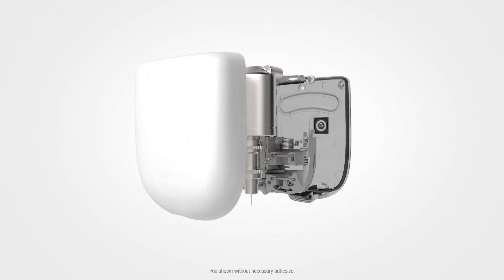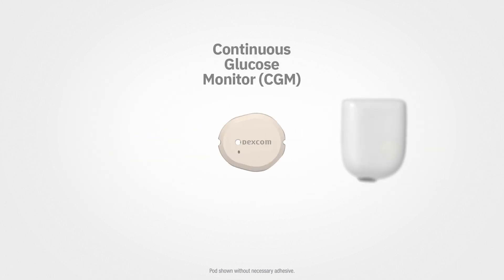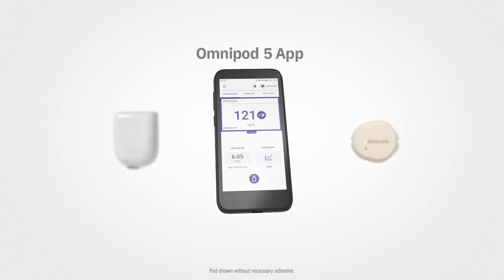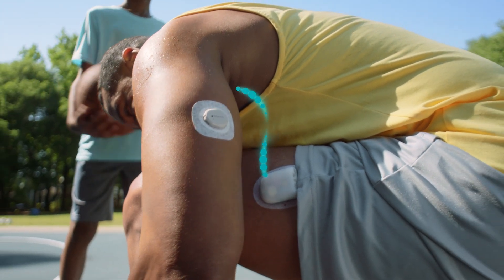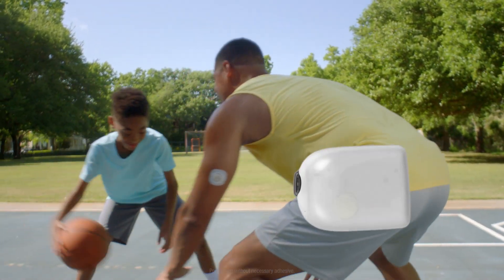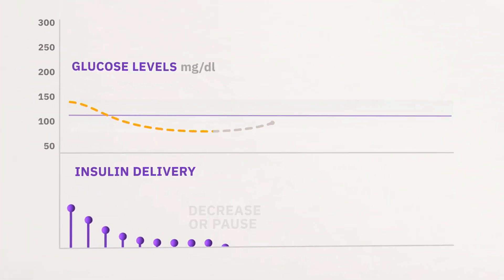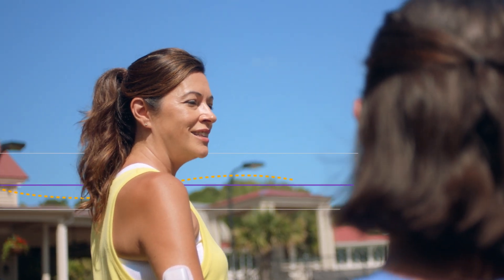The Omnipod 5 tube-free pod connects with the Dexcom G6 or Dexcom G7 CGM and the Omnipod 5 app with Smart Bolus Calculator. Every 5 minutes, the Dexcom G6 or G7 reports glucose levels to the pod. Smart Adjust technology within the pod automatically adjusts your insulin. The pod stays at work while you live your life.